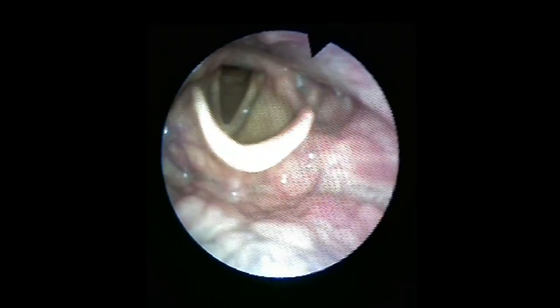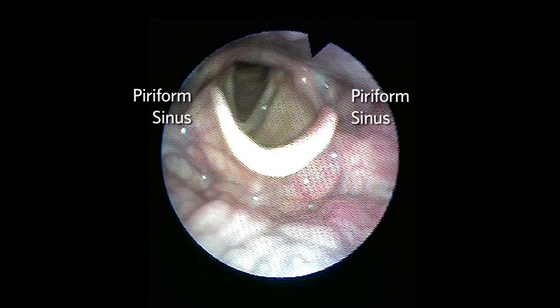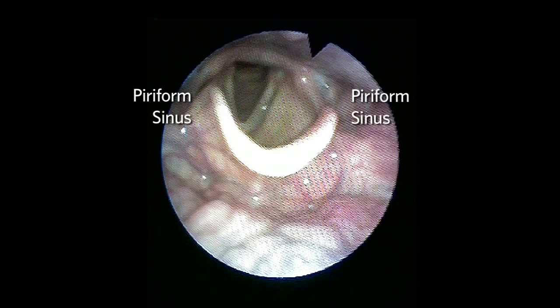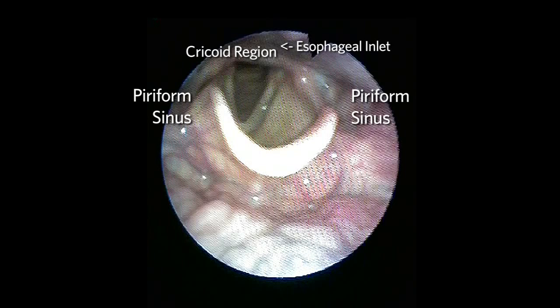Attention is also paid to the piriform sinuses bilaterally and the cricoid region posteriorly, as the esophageal inlet is located here. One can often view below the vocal cords and see into the subglottic space, and occasionally see one or two tracheal rings.